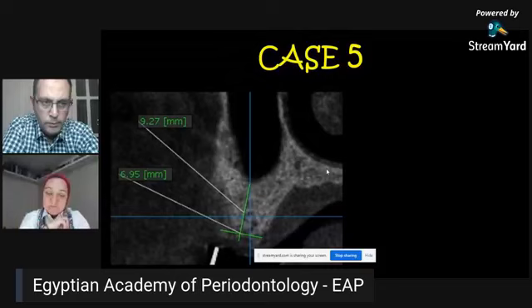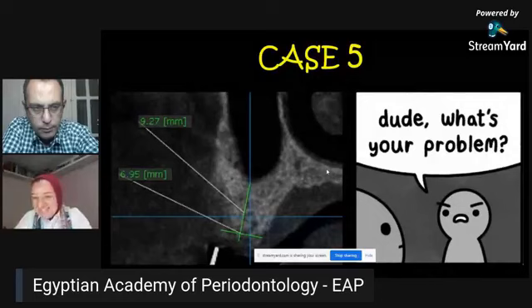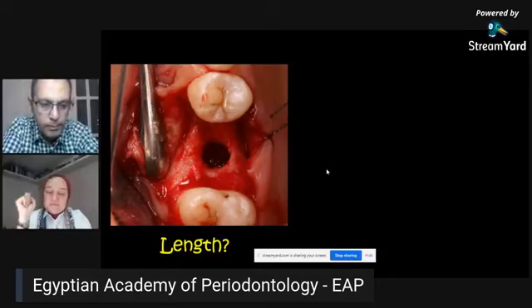This is not really a huge vertical deficiency. So you can go for what we call internal sinus lifting or crestal approach. What you do is you do the drilling around 1.5 to 2 millimeters shorter than your sinus floor. In case you are a beginner and it's your first time, I would recommend a minimum of 2 millimeters safety margin, because you are not very sure where your drill is stopping.